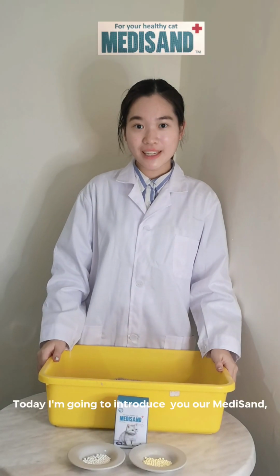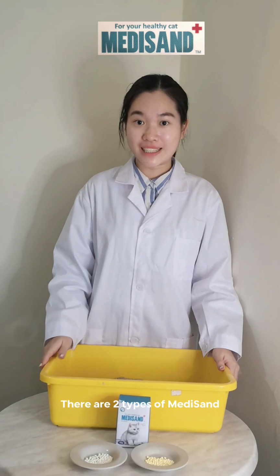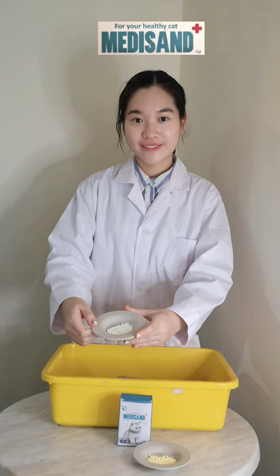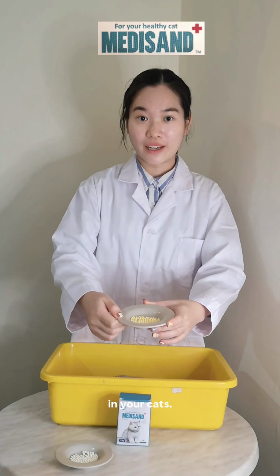Hello everyone, today I'm going to introduce to you our Medisand imported from Korea, a special diagnostic bead. There are two types of Medisand. This is used for the detection of hematuria, and this is used to detect the alkaline urine in your cats.